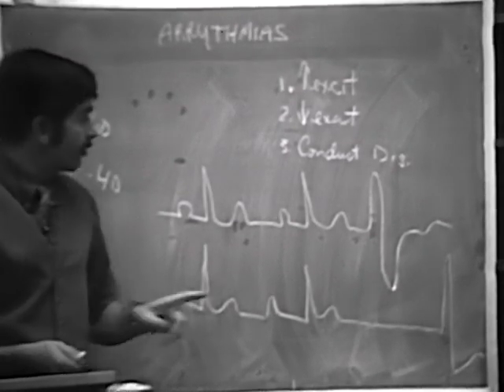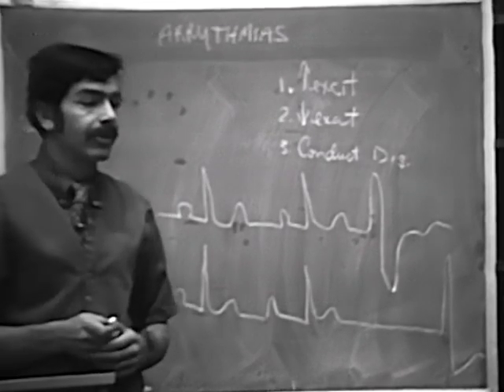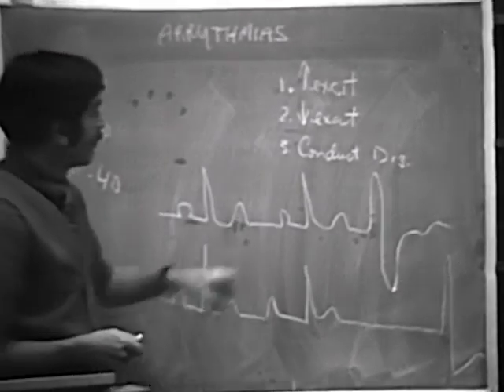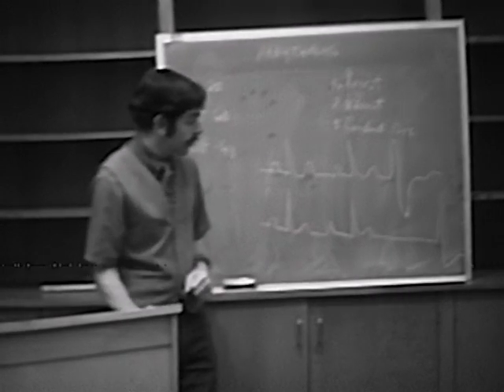So even though these beats may look exactly alike, they are quite different. Even though they can come from exactly the same focus in the ventricle, their mode of genesis is really completely different. It's a different mechanism. One is increased excitability, and the other one is decreased excitability.